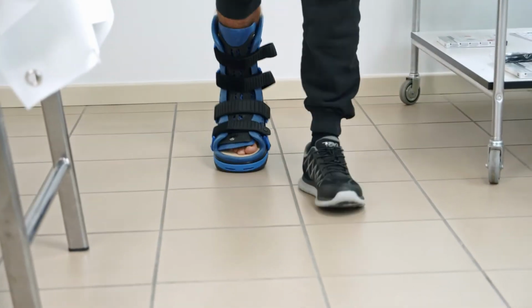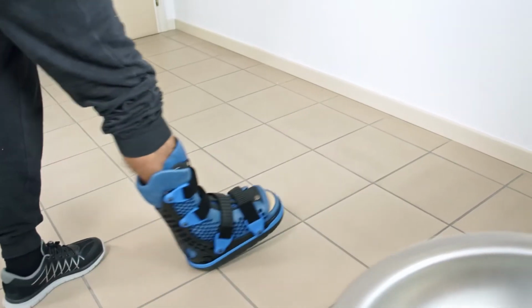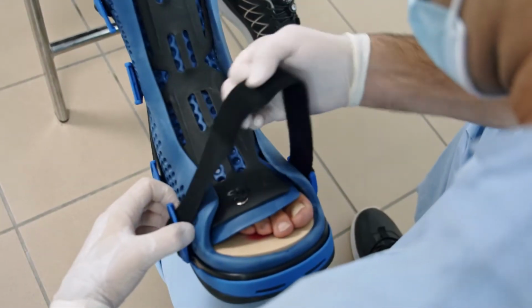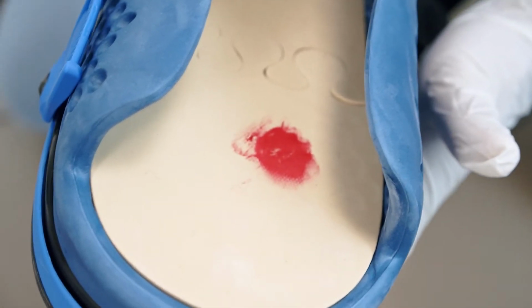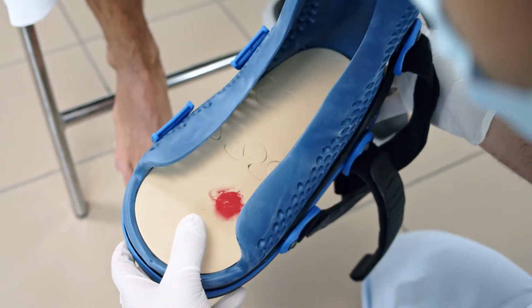We ask the patient to walk a few steps so that the surface area in contact with the foot will be marked around the ulcerated area. When removing the Walker device, the imprinting left by the lipstick on the plantar surface is clear, and this is the area where we need to reduce pressure by creating the offloading hole.